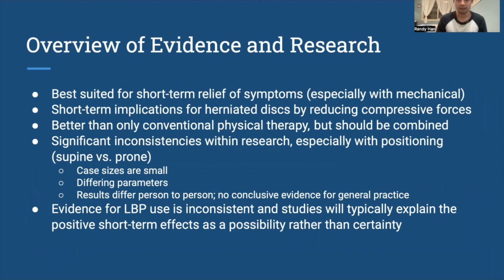But it is possible that traction can help with some short-term pain relief. At the end of the day, the research just isn't there to really suggest that this is what we should be doing. It could possibly help when combined with things like physical therapy or other therapeutic modalities, but at least on its own, traction is not going to be the greatest thing that we should be focused on when it comes to helping our patients with any cervical or lumbar pathologies.